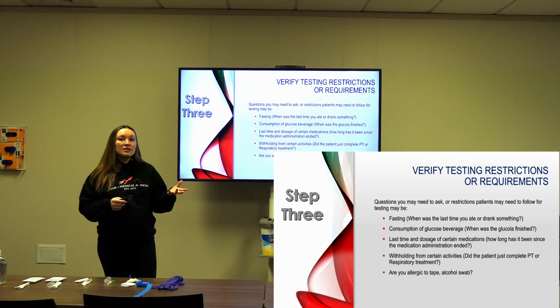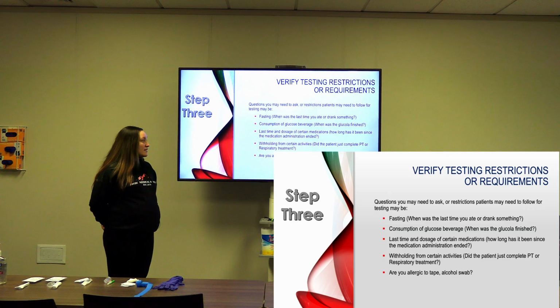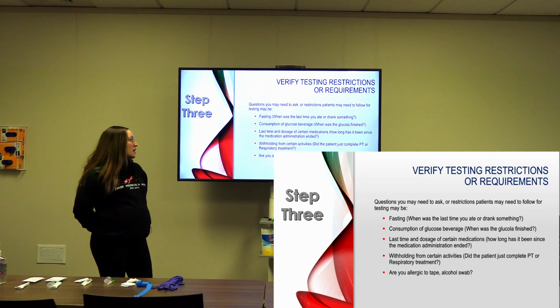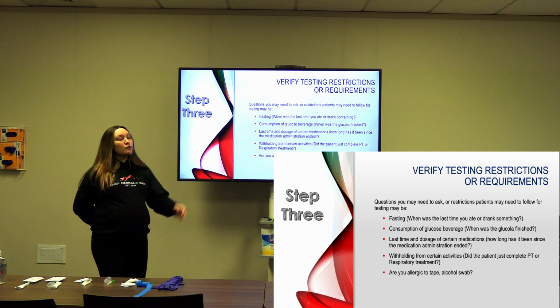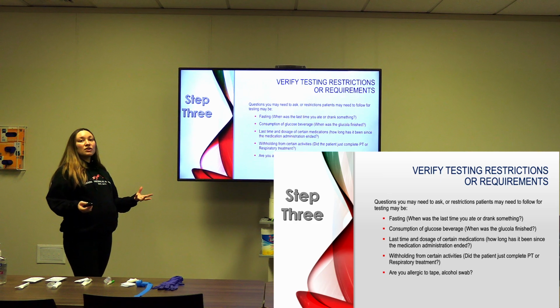Some tests we're not allowed to take if a medication is running into an IV. We have to wait for it to be finished. Withholding from certain activities. Did the patient just complete physical therapy or a respiratory treatment? Generally, after these things, we need to wait 30 minutes to an hour. And then, are you allergic to tape, alcohol swab, latex, and so on and so forth? Clarification questions, just to make sure that everything is going to go smoothly and that you're taking the test correctly.